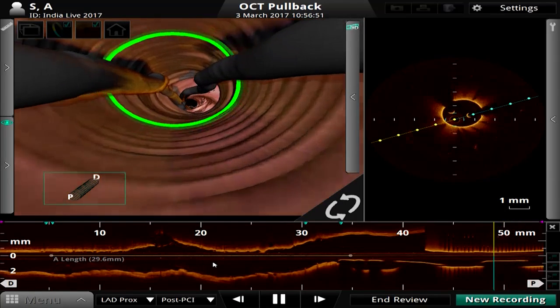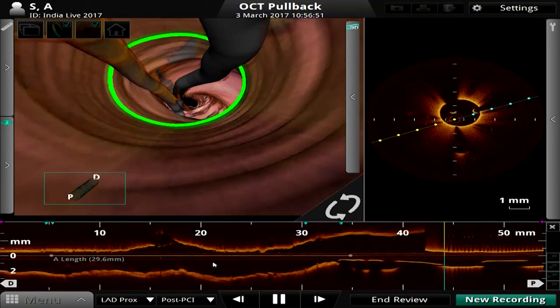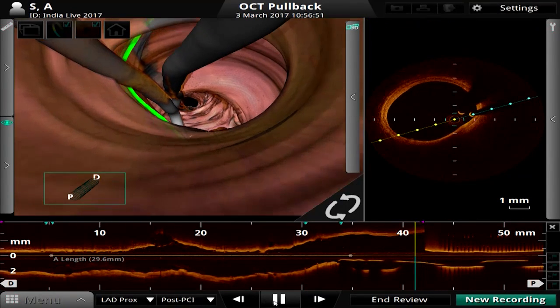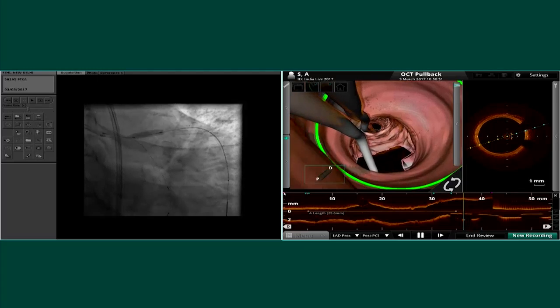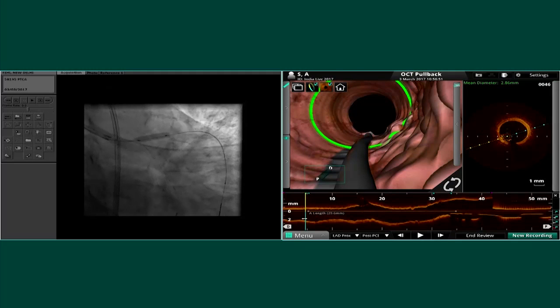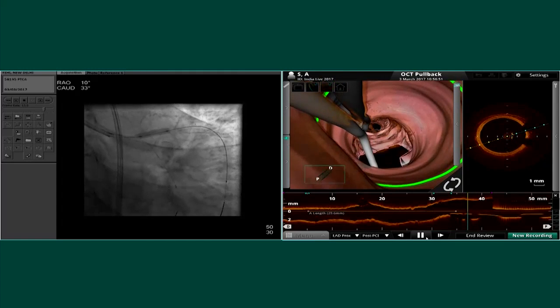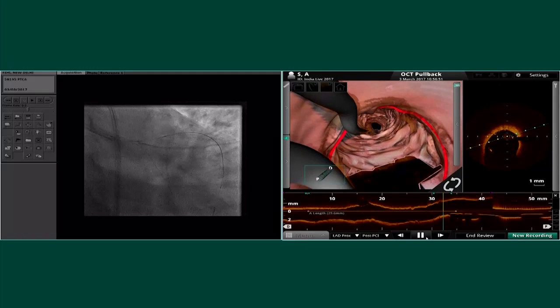Okay, let's go up to 4, 6, slowly. Can we see the angio? 8, 10. Angio, can they show the angio? Yep. Okay. 12, 14, 16, 18, 20. Stop. Deflate. Already now we see some struts.